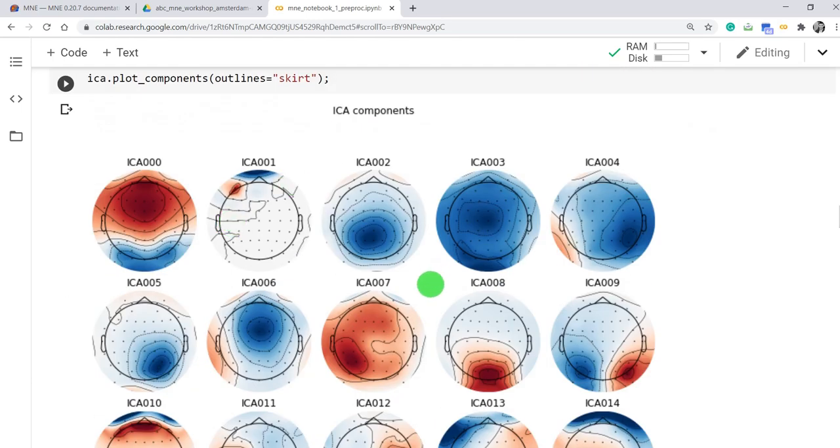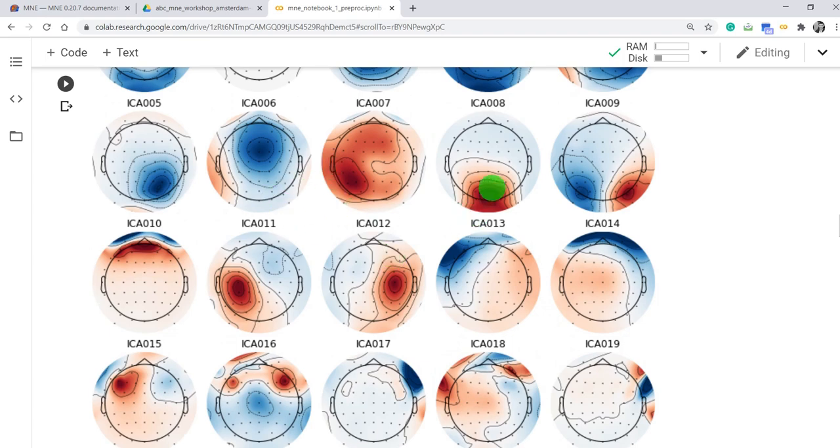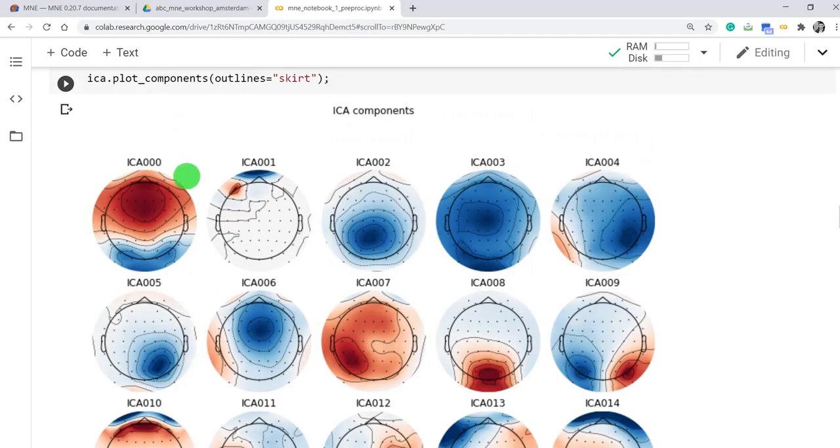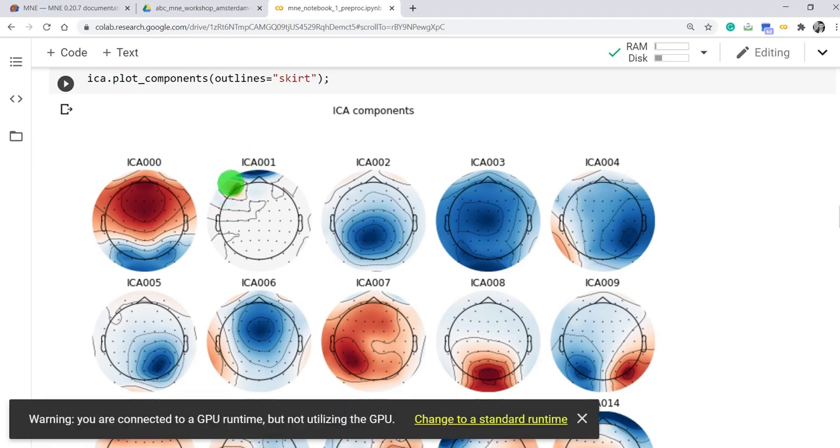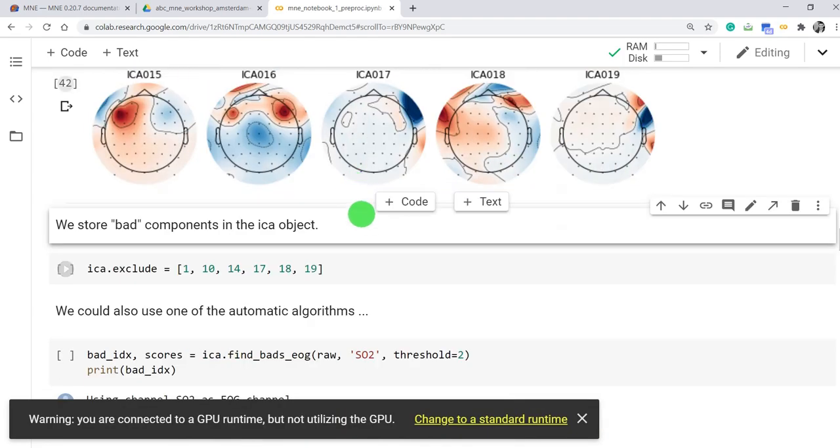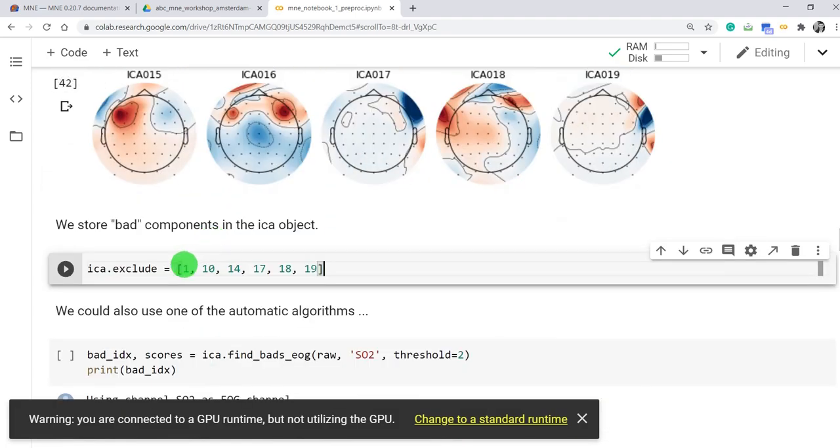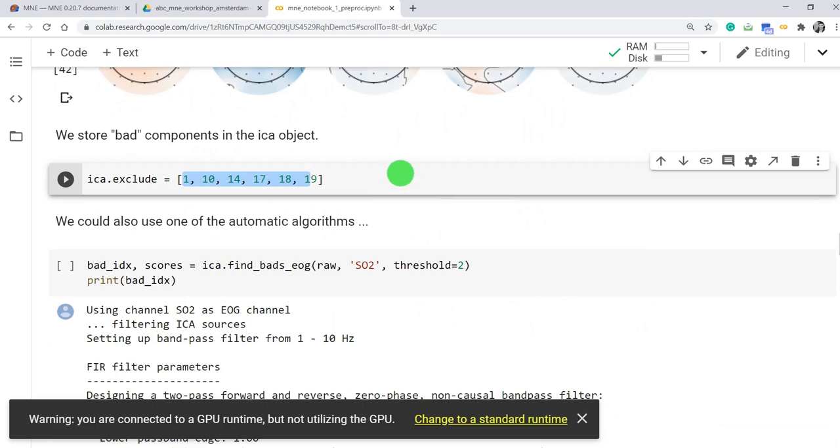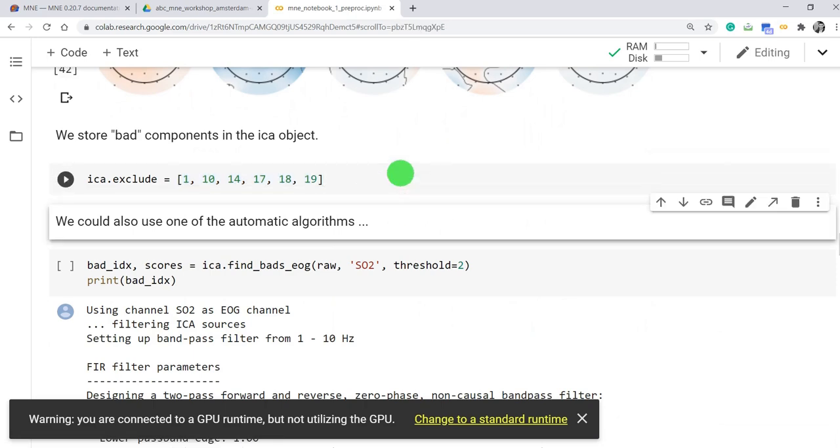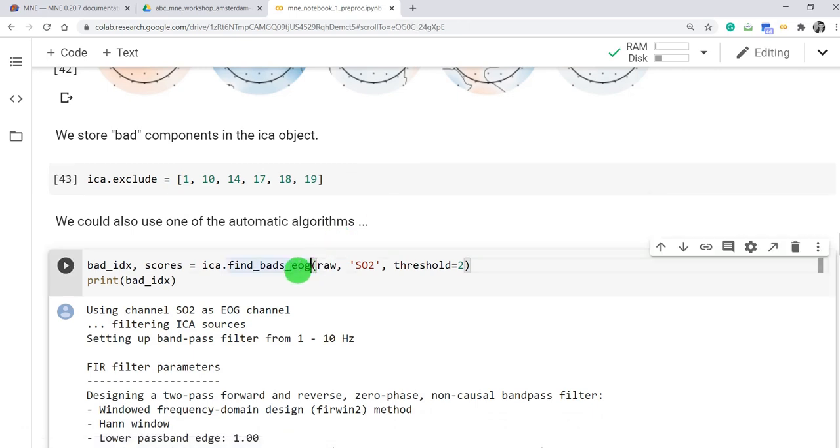So once this process is done, we can plot the ICA components, independent component analysis. So these are the ICA components that decompose the signal into different components. So the task after performing this ICA is remove the components that look like noise. Here we need some domain knowledge, but usually you want to find some kind of activities which is close to eye location and looks like abnormal activity, non-EEG-like. So let's select these components, identify it by the index. Try to remove. Theoretical formulation of ICA will be covered later in our lectures, but I just want to show you here some examples.